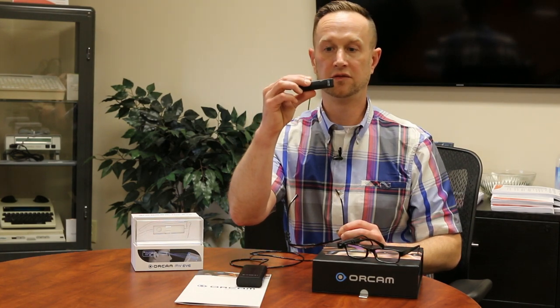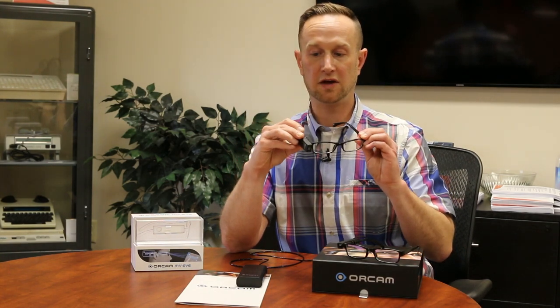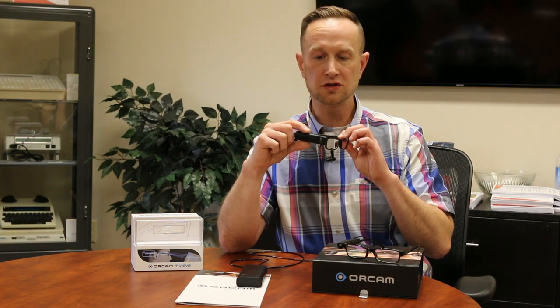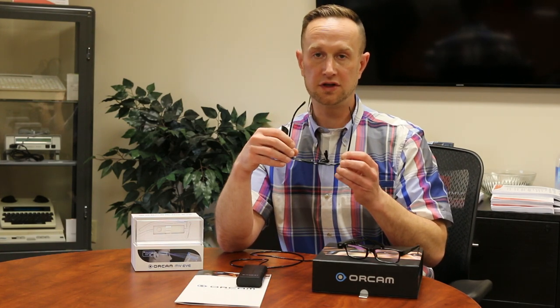With the MyEye 2.0, the entire OrCam is on the frames of the glasses — this is the entire device. It mounts to the frames the same way as the other OrCam. The camera is slightly larger and heavier, but still very small. You initiate reading with gestures just like with the wired version, using your finger gestures.